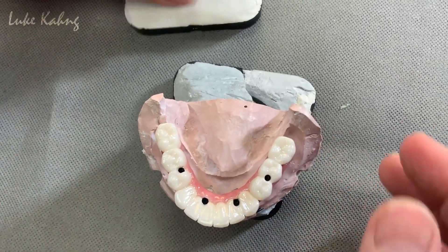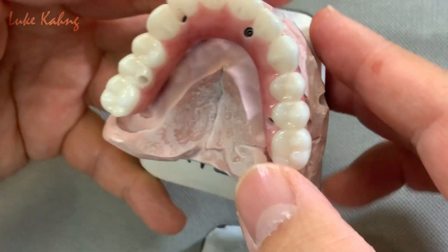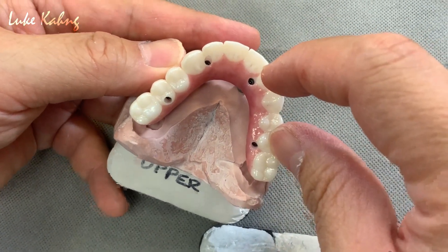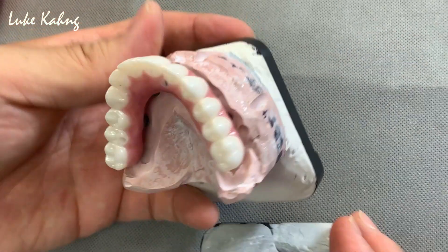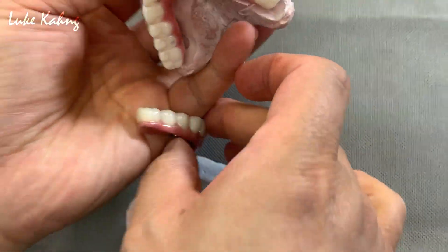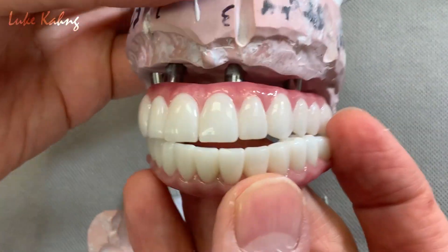Here is the upper, which is monolithic. Monolithic is pretty easy. I mean, that was a little bit long span, but we make the good thickness between the teeth and make the highest aesthetics between the tooth.